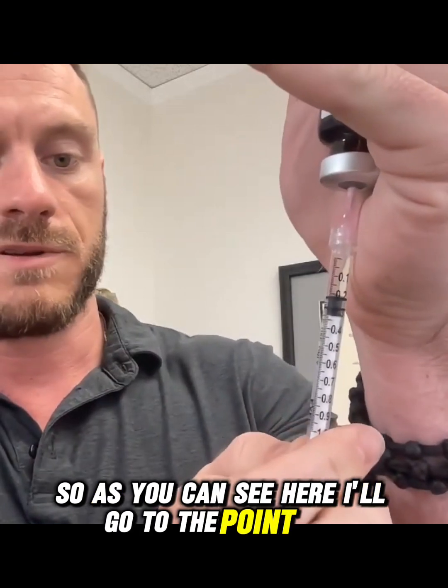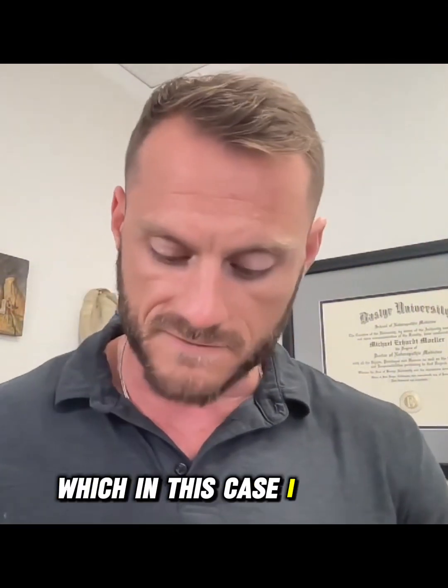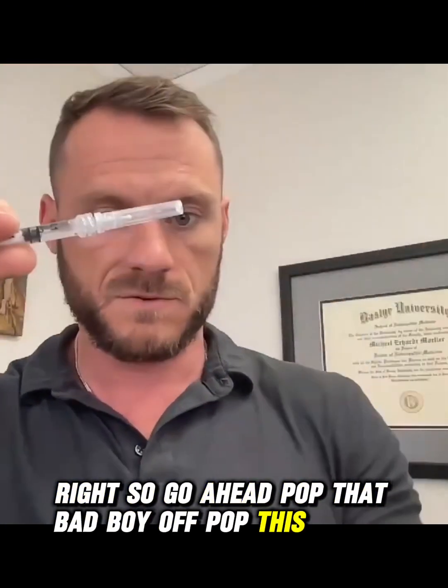As you can see, I'll go to the 0.2. Now I have the 0.2 drawn up, so I'm going to switch out this needle for something smaller — in this case a 27 gauge half inch. Pop the old one off and pop this one on.